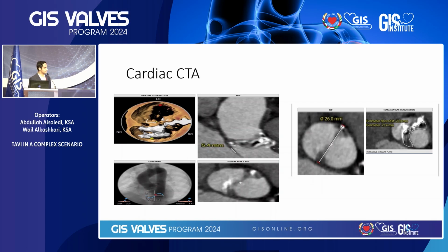Okay, last question. Ahmed al-Shatti, which valve are you going to use? I came late, but I would use balloon expandable. Balloon expandable. For type 0, I always use. Abdullah, you did the presentation, amazing presentation. Which valve?